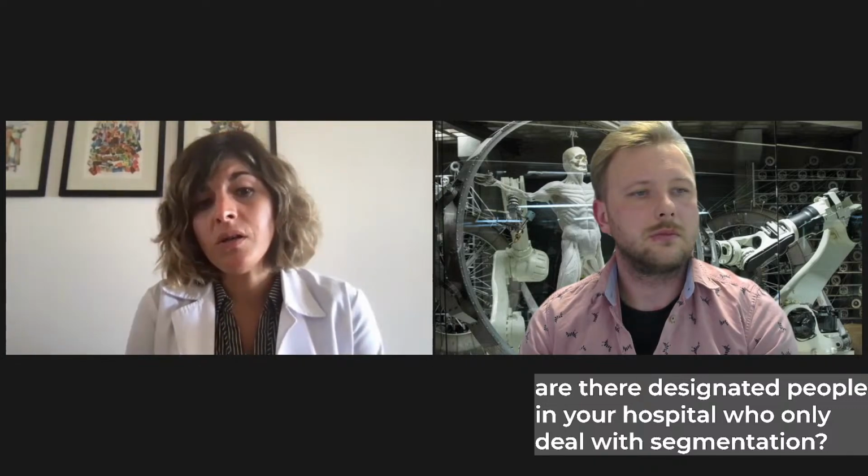On the one side, you want the surgeon that will be working with your patient to tell you what he needs to see. He needs to see the tumor and the relations with the bone and the relations with this or that vessel, depending on what procedure he's going to have for that patient. After that, you need your radiologist to check that image and to work very close to the engineers, who may help you. In our case, we are a very low resource hospital, so mostly we do everything as radiologists, and sometimes we get the help of an engineer for complex stuff. And we work together on the segmentation part.